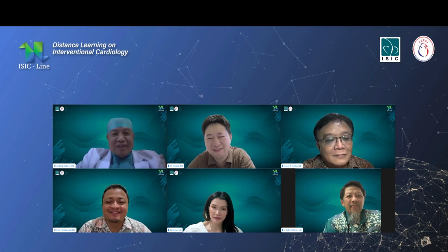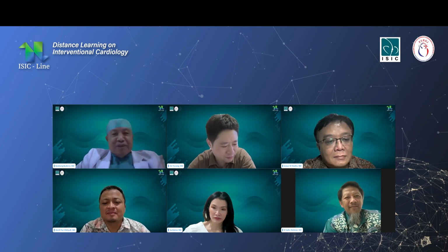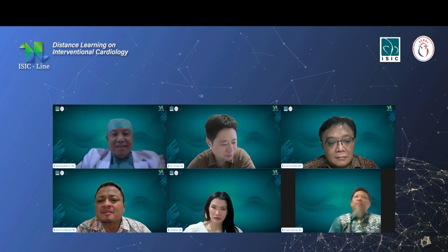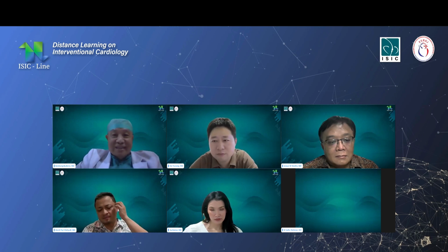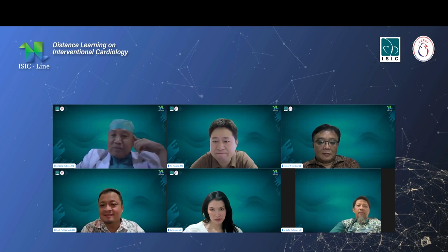Thank you, Prof. Yuxiang. In my opinion, the main difference between DCB and BRS is the temporary scaffolding. DCB doesn't have temporary scaffolding. So BRS will give an advantage in terms of avoiding vessel recoil or something like that. DCB cannot do that. I think that's the main difference. Prof. Saifur, please.